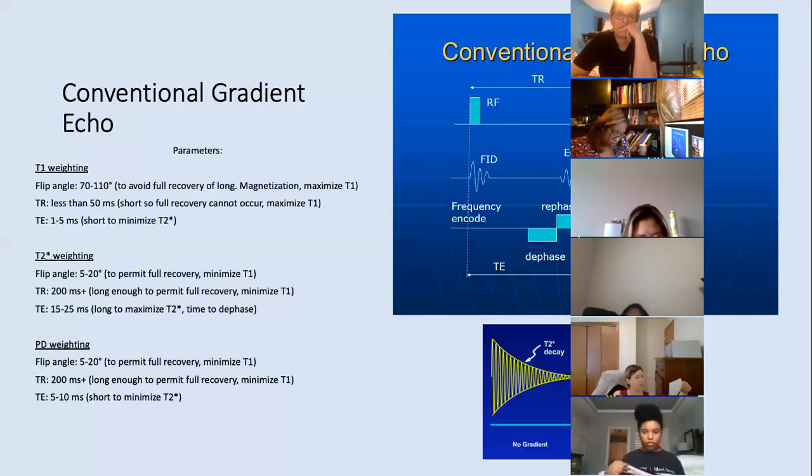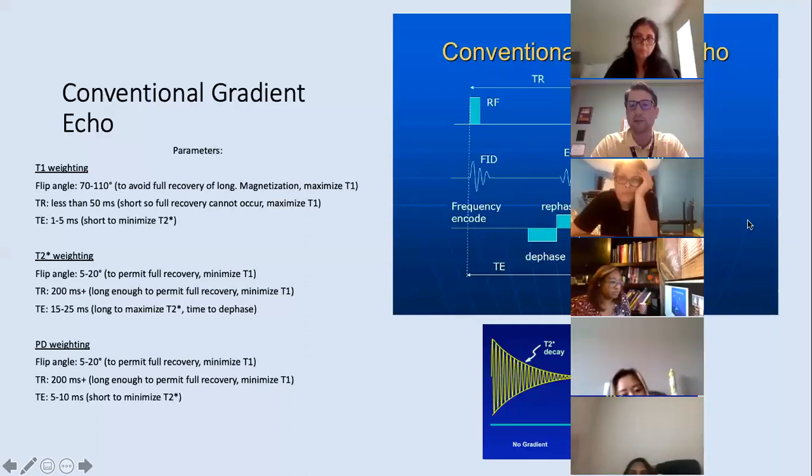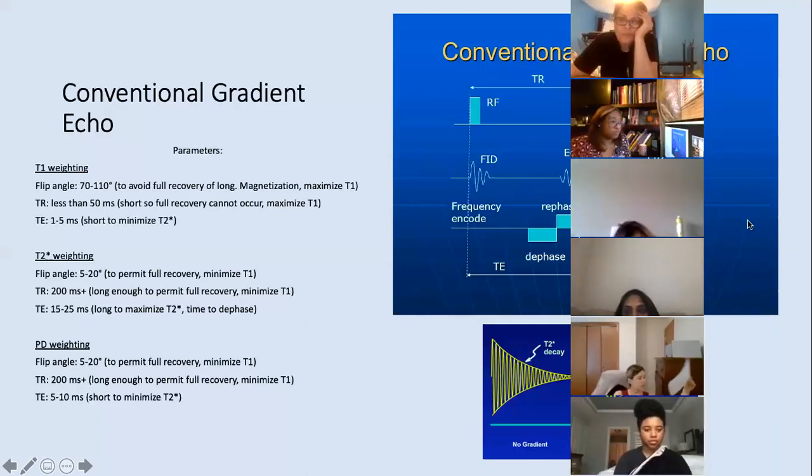You could also just wait a couple of minutes before you start the next pulse sequence. That will allow time for them to dissipate that heat too. That's always an option, just to wait a little while, let them dissipate that heat. Turn the fan on too. I think that patient Tisha had the other day, their SAR limits were getting high. If you just turn on the fan and get some air circulation, that could help. Well, that patient was wrapped in like 3 blankets, I don't know if you remember. So we went in and took her blankets off also. I don't know if that made a difference though.